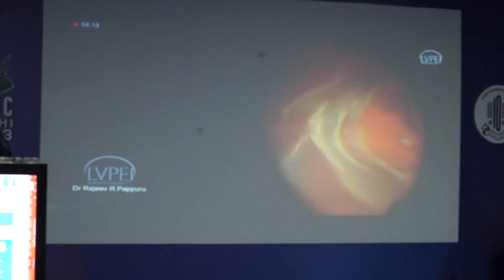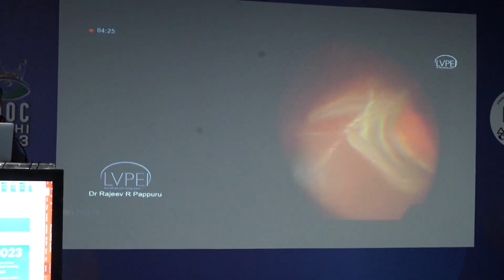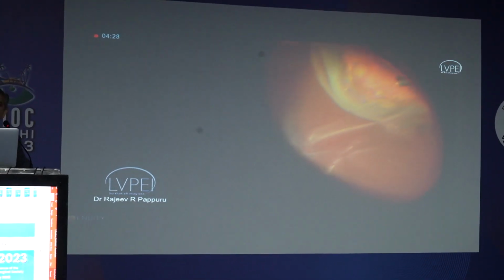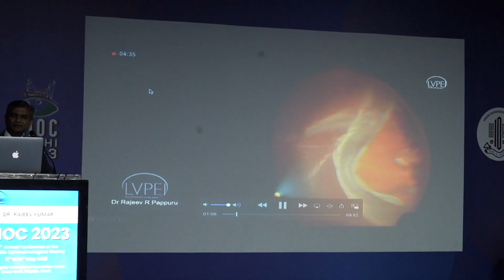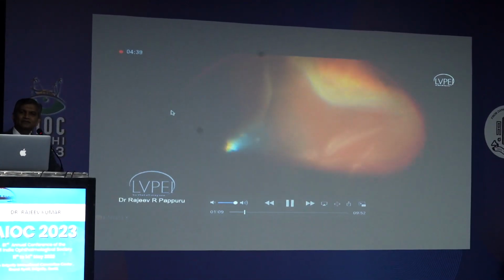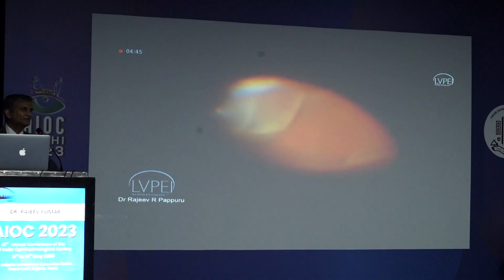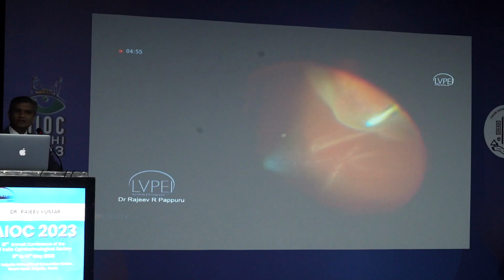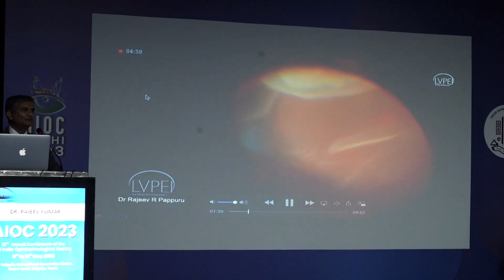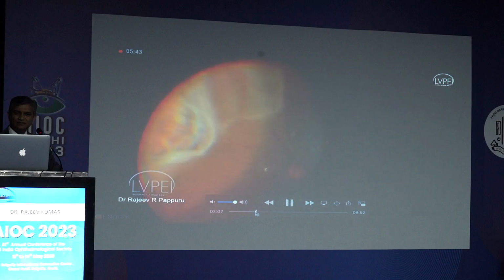I was thinking maybe somewhere we had missed laser, so I tried depressing to see if there is anything connecting anywhere. I could not find anything there, so we went ahead to search the other area. You can see this small skirt of vitreous which was there in the periphery. I didn't do a base excision there because nothing else was there. Going further down, I have done laser almost till that area. Beyond that I didn't do laser because it's normal retina, and I want to do as little laser as possible on normal retina. So I didn't find anything there.